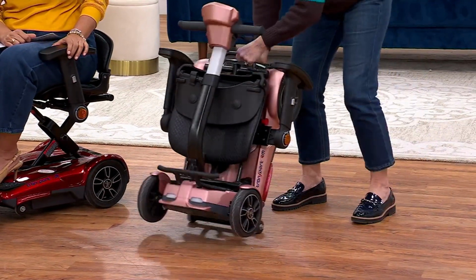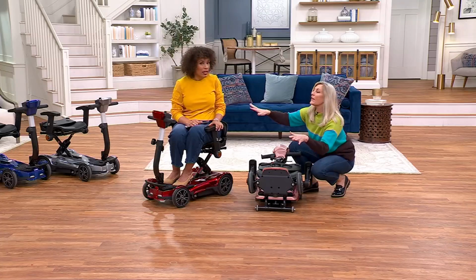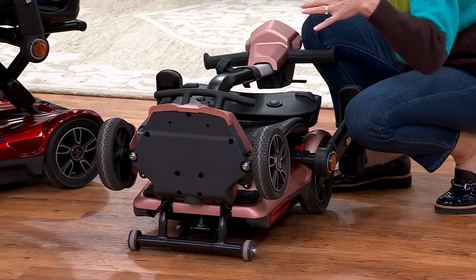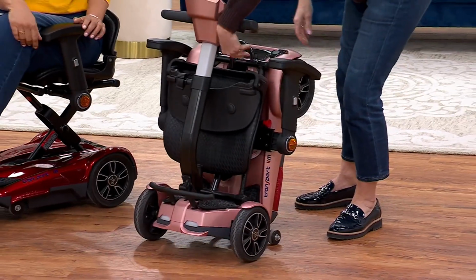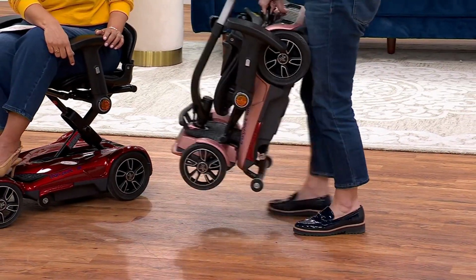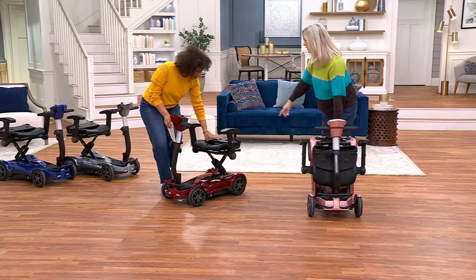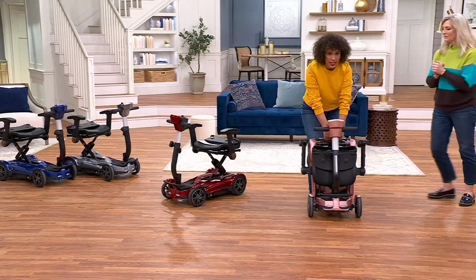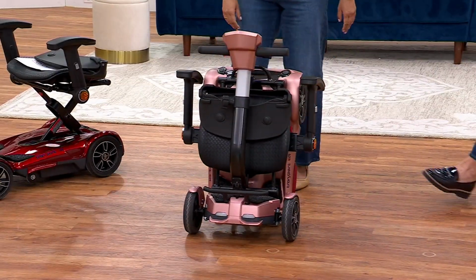And if I had to pick up 55 pounds down here, Sam, I would not be able to do this. Even if it was my second 25th birthday, even back then, I wouldn't have been able to do this. But tipping it up, lifting it from here, and throwing it in the back of your car. May I? I want to have a go. Yeah, absolutely. So there's a pin on this side. Oh, no, I just want to lift up yours. I just want to see how heavy it is or how light it is. Oh, yeah. Doable. Absolutely.